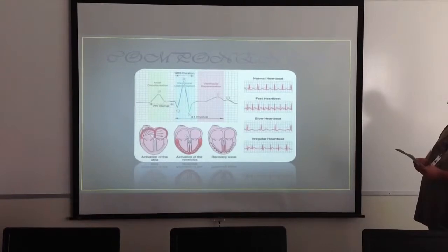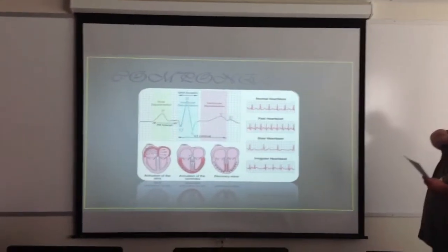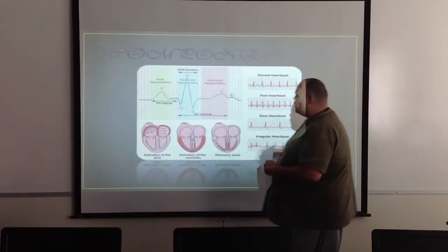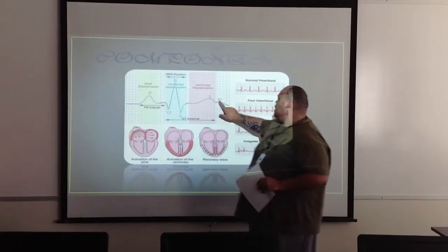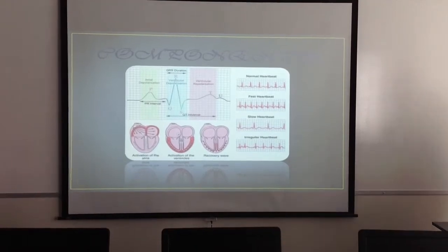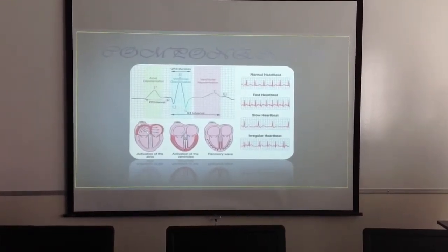Here you see the components of the EKG comprised in cycles of 5 waves. You have the P, the Q, R, S, T waves, and occasionally the U shows up, very rarely. These are comparable to altered phases of heart activities.